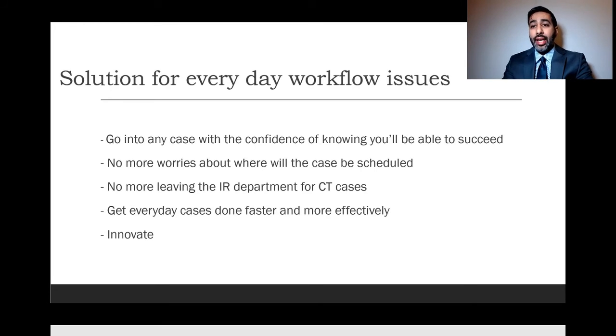For example, I had a case about 2-3 weeks ago, a 40-year-old, portal hypertension, gastric varices, hemorrhagic shock. Not a candidate for TIPS procedure, had a previous BRTO for a gastric varix, needing additional embolization via a transhepatic approach, knowing that I had ultrasound, fluoroscopy, and CT at my disposal to get into the vessel that I needed to get into the portal system. It gives you complete confidence, especially when you're talking about 1 o'clock at night and you want to get out without any issues.